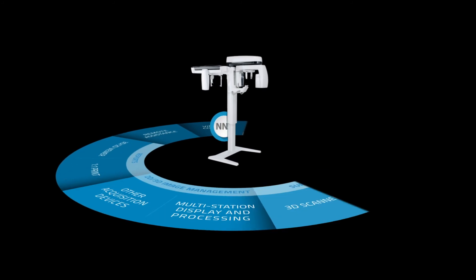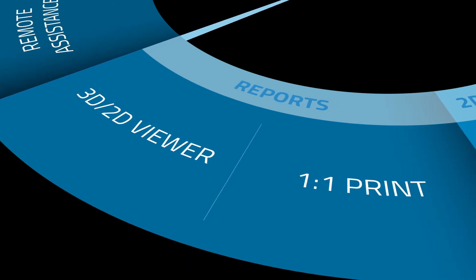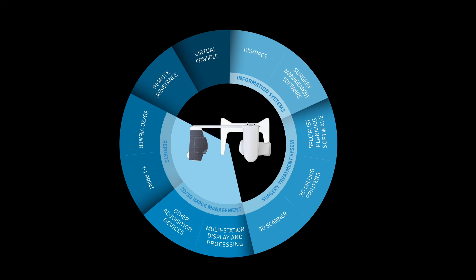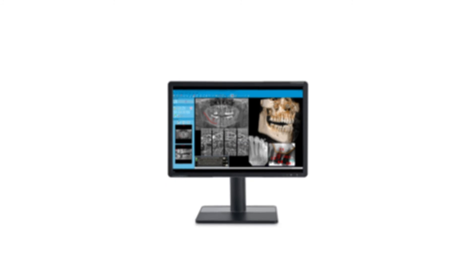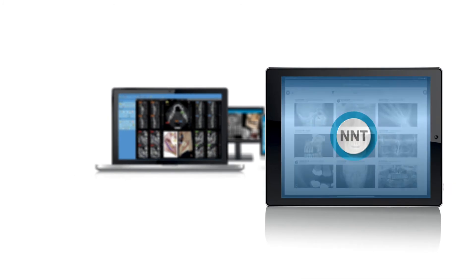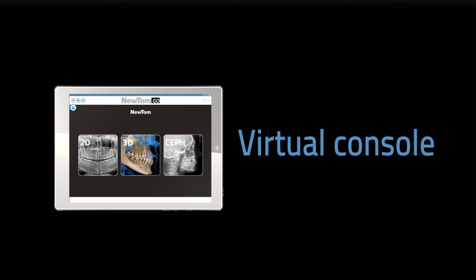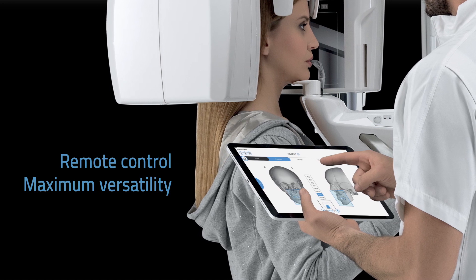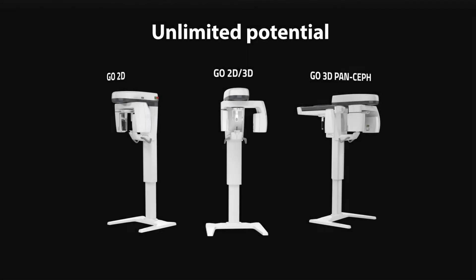Users will enjoy smooth workflow. Clinical and diagnostic activities become much easier thanks to excellent connectivity and full integration with modern systems. All functions required to perform, process, display, and share 2D and 3D examinations are available with NewTom's NNT software. Different application modes and functions help dentists with all clinical applications. It's user-friendly and fully certified. Settings required for acquisition can be easily controlled from a remote virtual control panel on a PC, laptop, Windows tablet, or iPad.